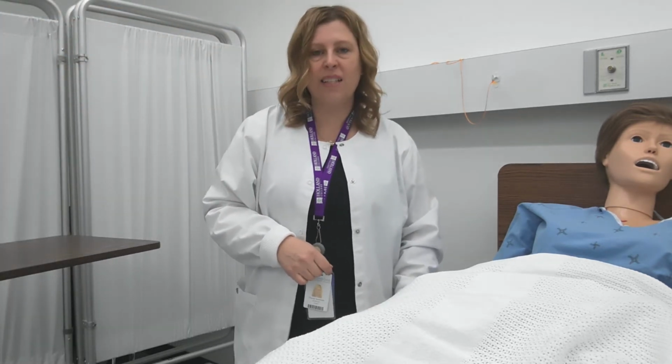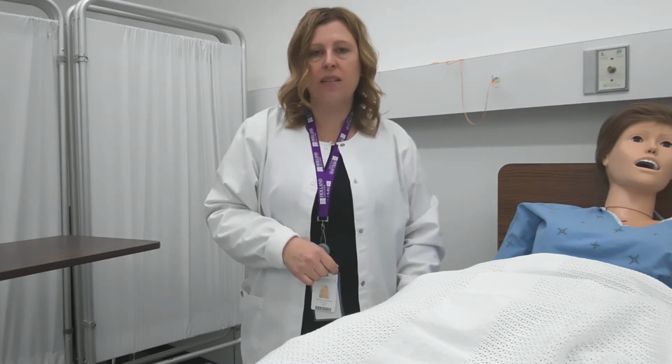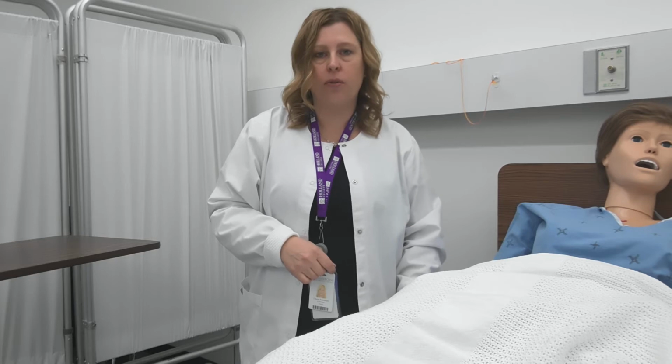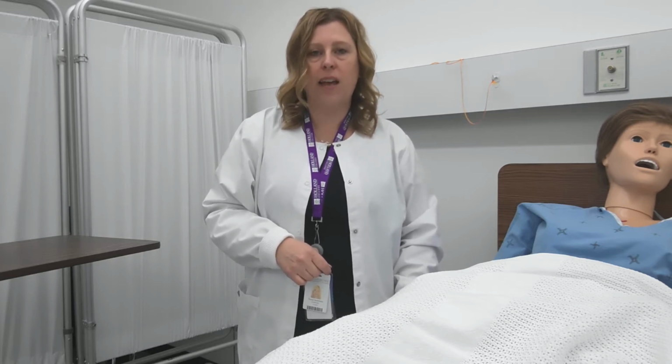Hello everyone. In today's video, I'm going to be showing you how to remove a Foley catheter. Before we get started, we want to ensure that we have a doctor's order for removal. We're going to check our policy and procedure manual, and we're going to do good hand hygiene.